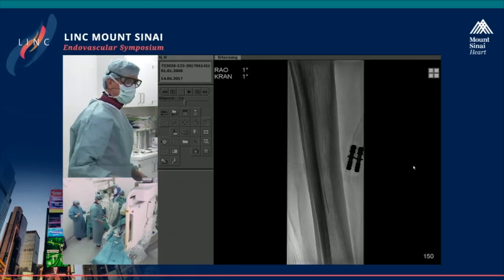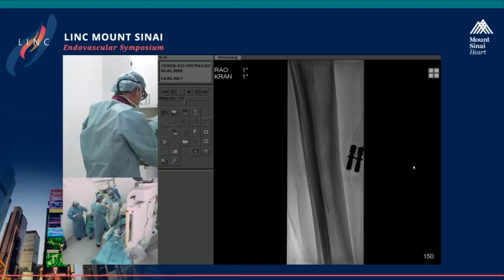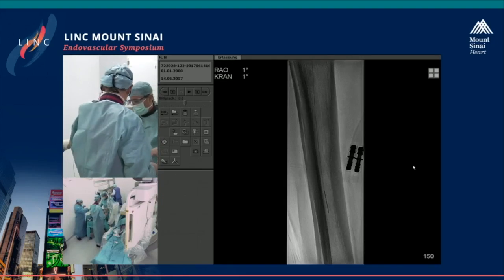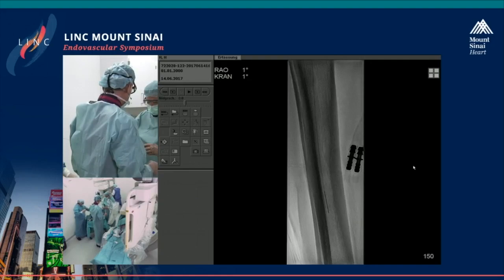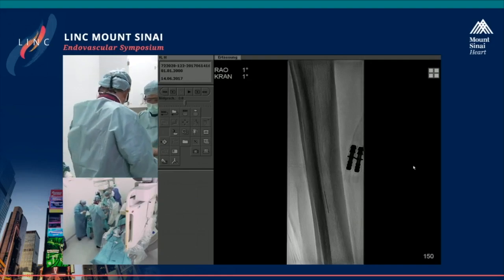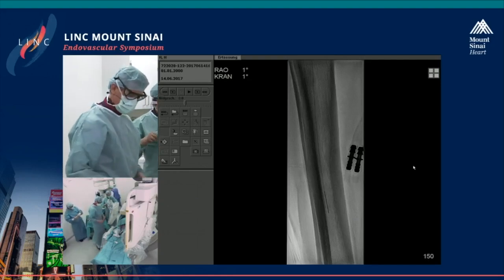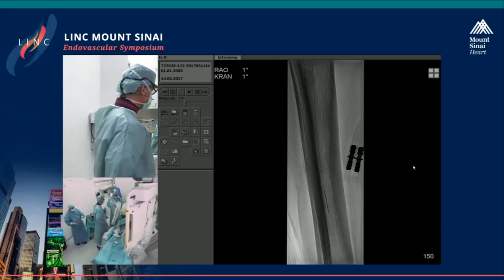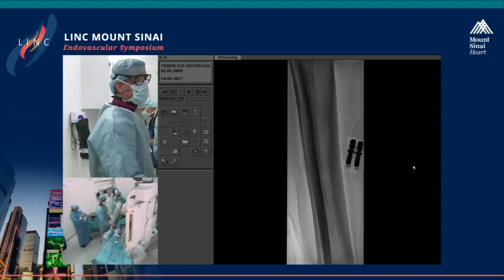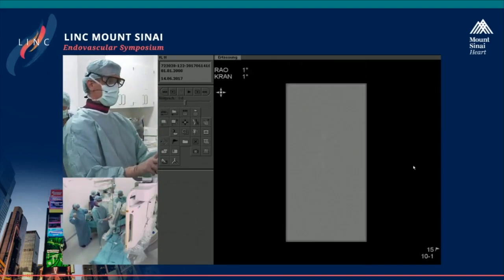You have seen now some successful injections, and then we went into the P3 segment, and there our device seems to be too small now, and therefore we upsize now to the next one, which we can use for diameters of 3 to 6 millimeters. That's also the reason why you mix the drug with contrast, because if you don't reach the wall and you inject the fluid not into the vessel wall but rather into the lumen, then with the contrast you immediately realize that. So it's kind of a quality control for reaching the adventitia.